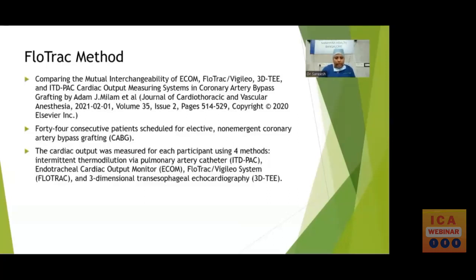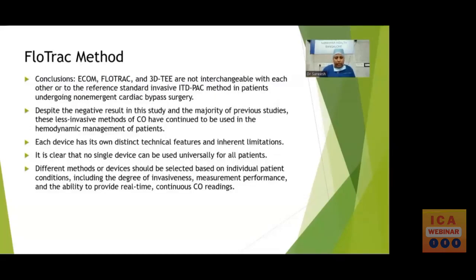In another study conducted by Adam et al., they compared cardiac output monitoring using four methods. One was the intermittent thermodilution by pulmonary artery catheter, endotracheal cardiac output monitoring, FloTrac, and 3D transesophageal echocardiography. This study was conducted on 44 patients who underwent elective non-emergency coronary artery bypass grafting surgery. They found that the endotracheal cardiac output monitoring, FloTrac, and 3D transesophageal echocardiography are not interchangeable with each other or with the reference standard, that is the invasive thermodilution PA catheter method, in patients undergoing non-emergent cardiac bypass surgery.